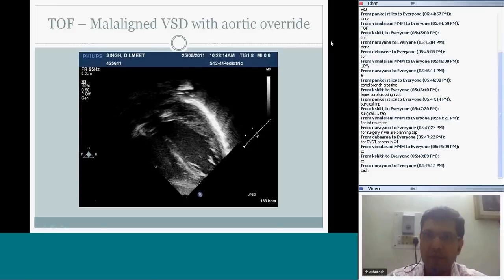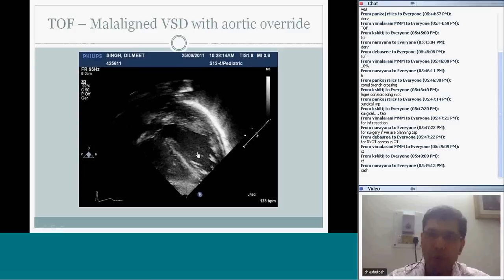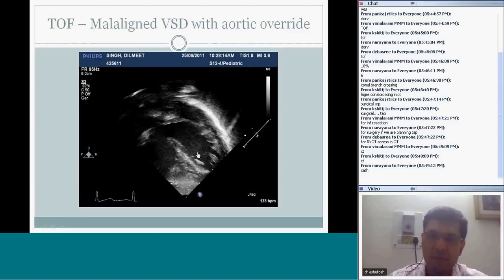So, let me show you some videos. Actually, I should have removed the heading, but let's see. So what view is this now?